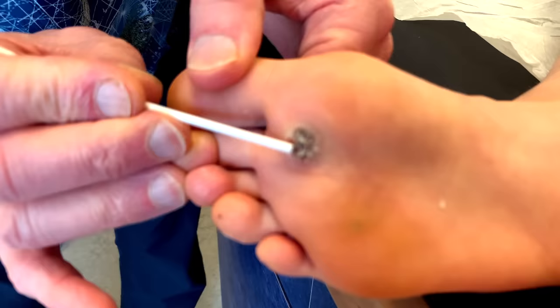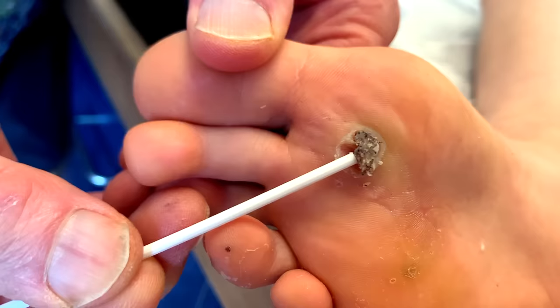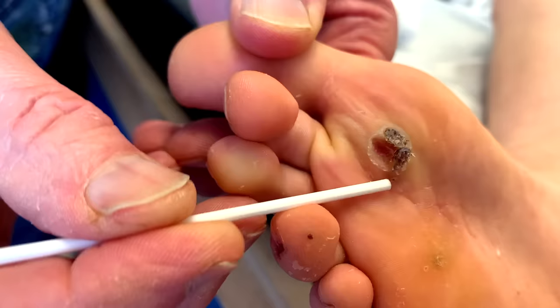I'm going to just get a little closer and sort of lift that up a little bit. Look at that — it lifts up quite a bit. So this is something different that I haven't usually done. I don't think I've ever shown this on video. We're actually separating that wart right off. Look at that — goodbye wart!